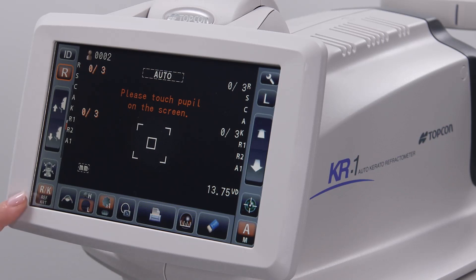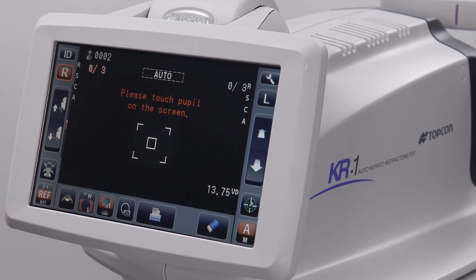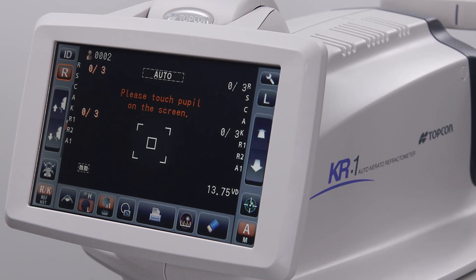The measurement mode icon determines the amount of information that will be acquired during the measurement. Tapping this icon will switch the setting from RK to keratometry only to refraction only and then back to RK. By leaving the setting on RK, the device will acquire both autorefraction and keratometry values.